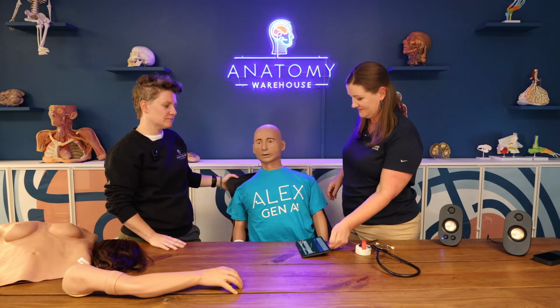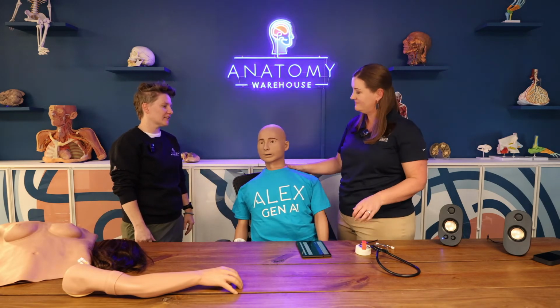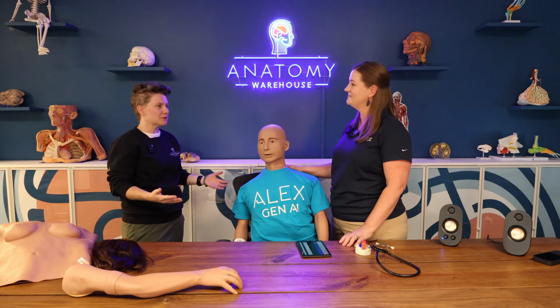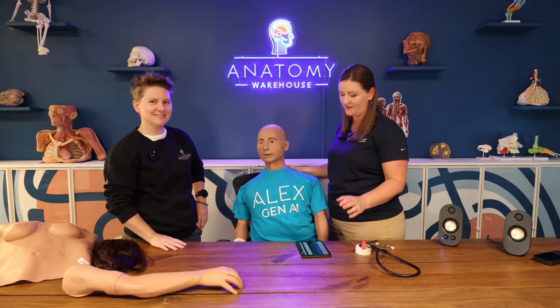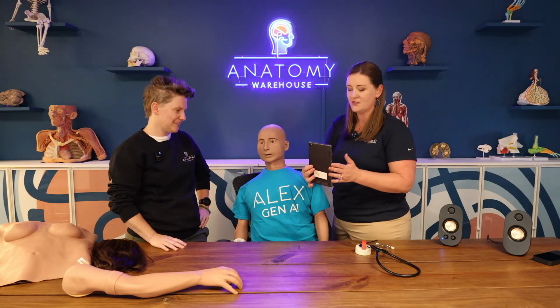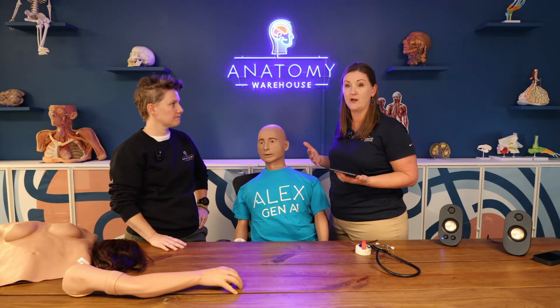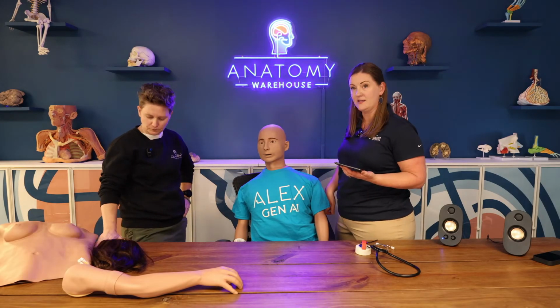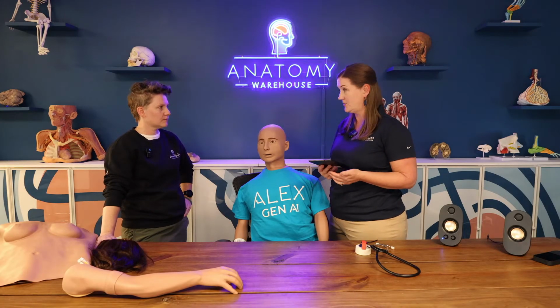But this is part of what we get into in training: you need to be able to adapt in real time to anything, including internet connectivity and different issues. So on his side, there's some different things as well. For the folks out there that are really truly interested, on Alex's side again is the port to hardwire him into the internet if they so chose.